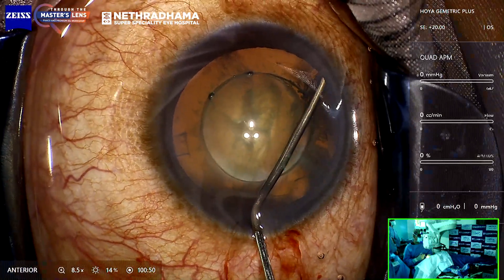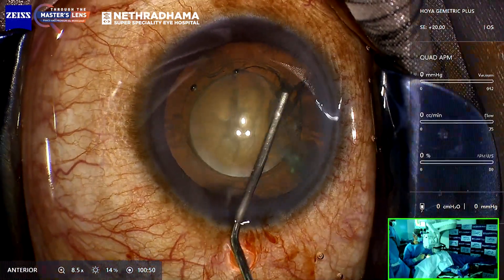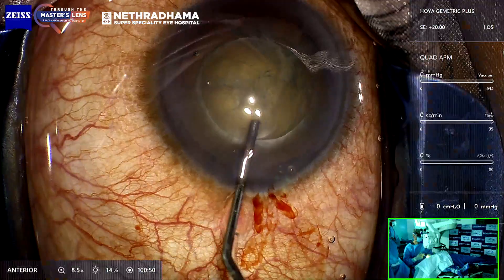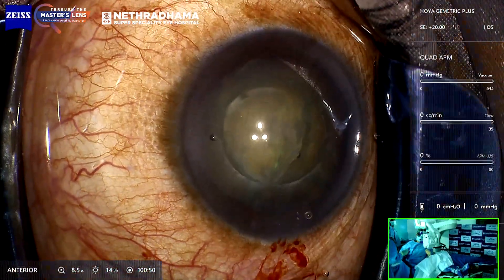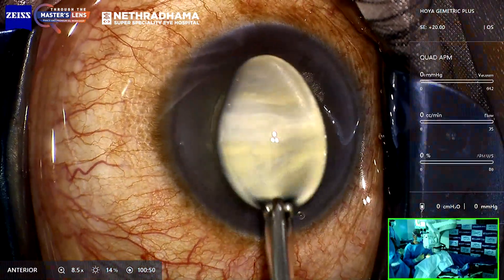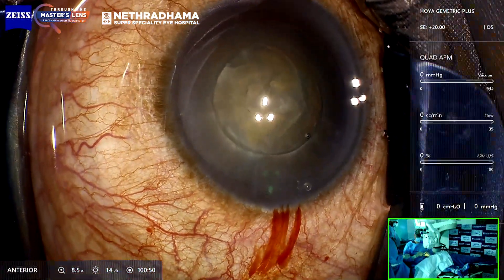This is the hydrodissection. Go with the hydro cannula underneath and you see the posterior fluid wave, you see the nucleus, and you see the surface rising. Decompress, and with the cannula it will rotate. You just need to do that one step — hydrodissection — and then put in viscoelastic.